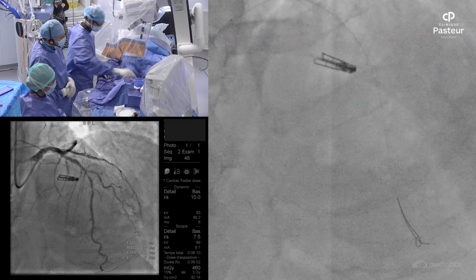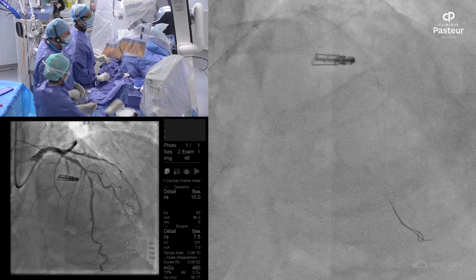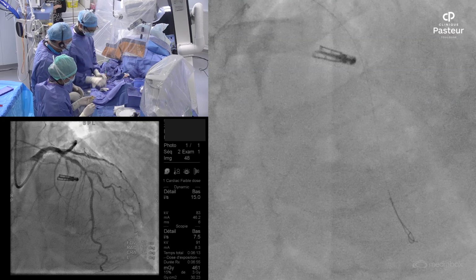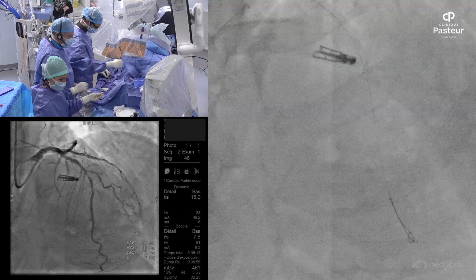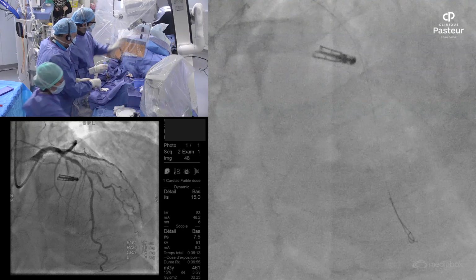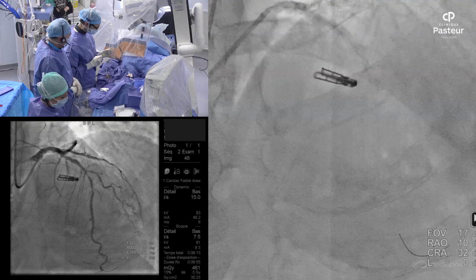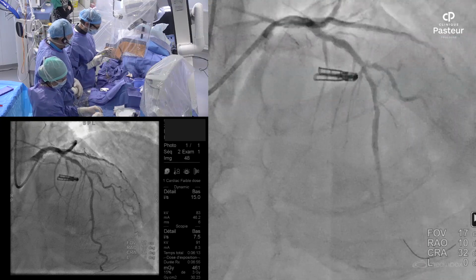This is a really good point you made, Flavio, and the others made as well: with atherectomy, you don't lose side branches, whereas if you use Shockwave, plaque shift can happen. So one of the benefits of atherectomy is probably reducing the risk of plaque shifting into the side branch. This is very important. This is one of the reasons why side branches do not occlude when you do rota, because you are not pushing the plaque to the ostium, you are just polishing the lesion. But this will happen when you do the balloon dilatation. So this is why now we put the second side branch wire.